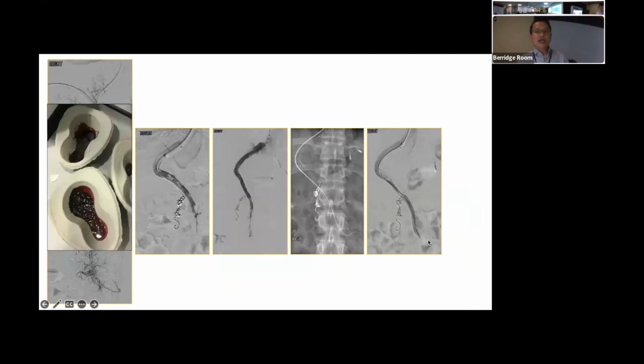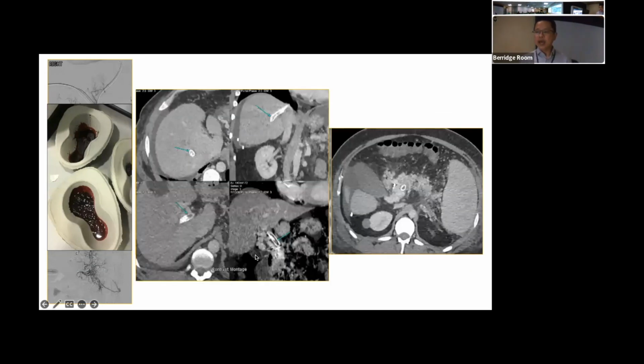However, despite that, he continued to have very severe GI bleed. And on the CT scan, you will note this is Dave Bowden putting arrows showing what is patent and not patent. So here, portal vein here, TIPS is patent, some occlusive disease here. And because the inflow from the SMV is so poor, I didn't think there was much that we could offer, but you can see the substantial varix here around the paraduodenal area. Endoscopy also failed to address that, a quite difficult area to address.